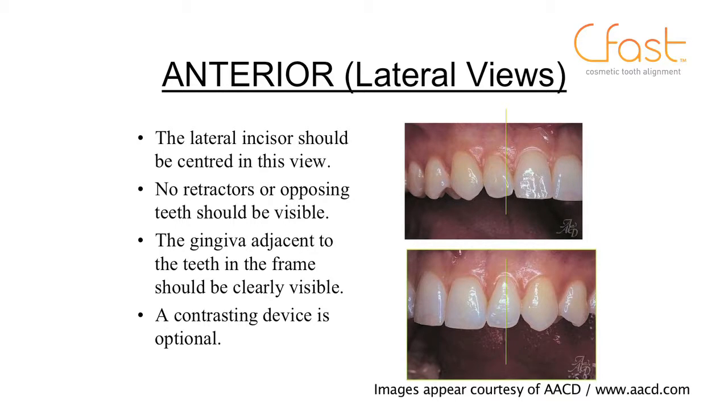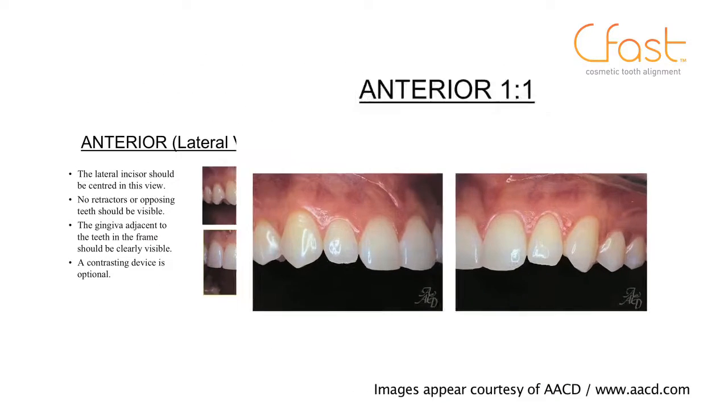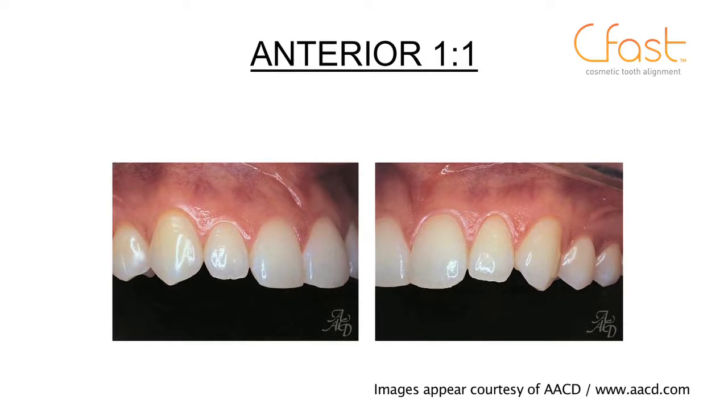No retractors should be visible. Gingivae again clearly visible. Again, a contraster is optional. And we just want to see the contralateral central incisor if possible. And that's another example of the left and right one-to-one views.